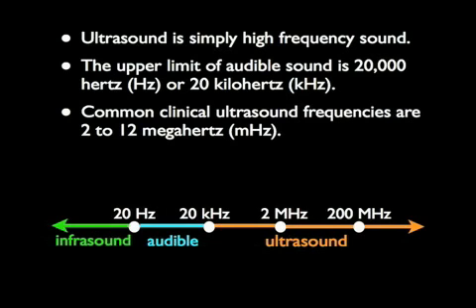Ultrasound is simply high-frequency sound. The upper limit of audible sound is 20,000 Hz or 20 kHz. Common clinical ultrasound frequencies are between 2 to 12 MHz.